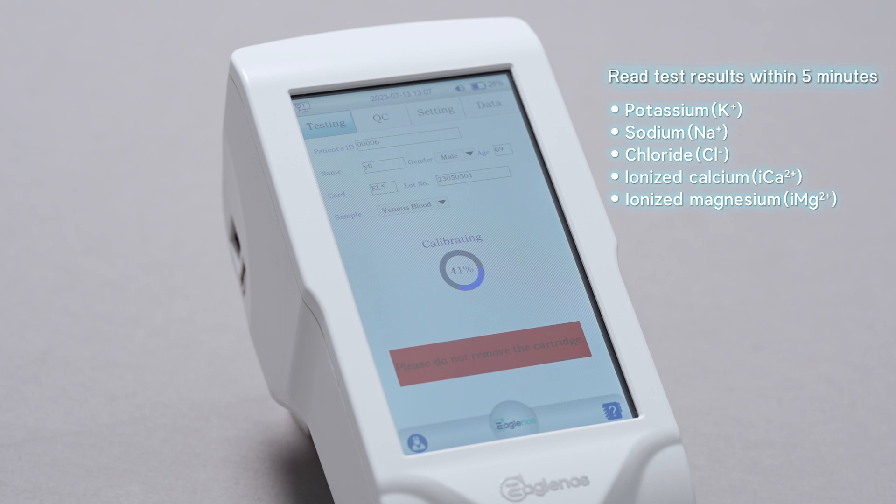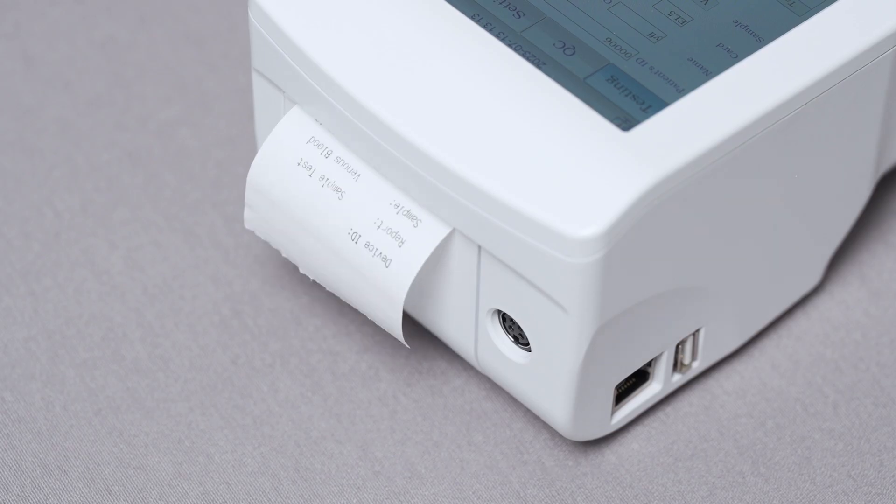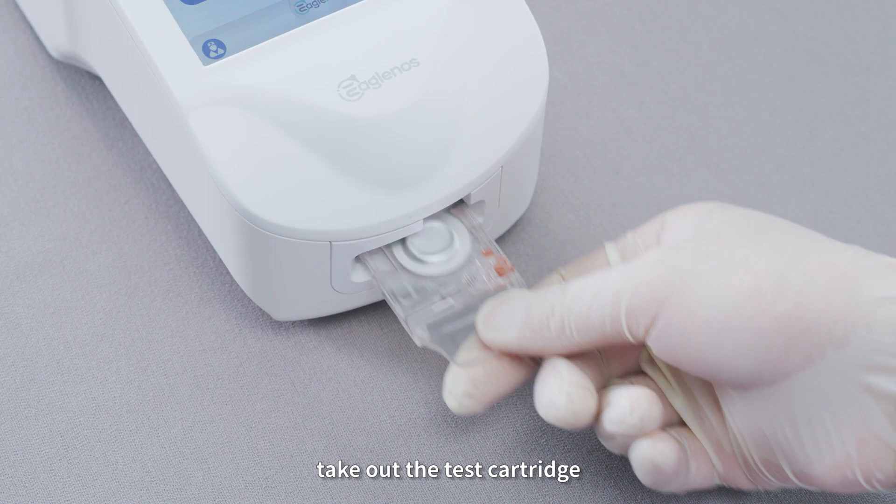Results include: potassium, sodium, chloride, ionized calcium, and ionized magnesium. Print the full test results. Then remove the test cartridge.